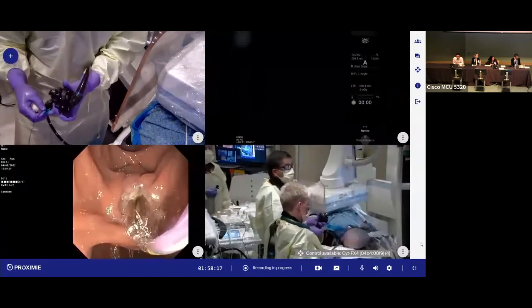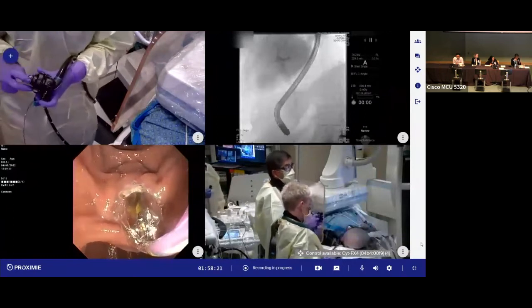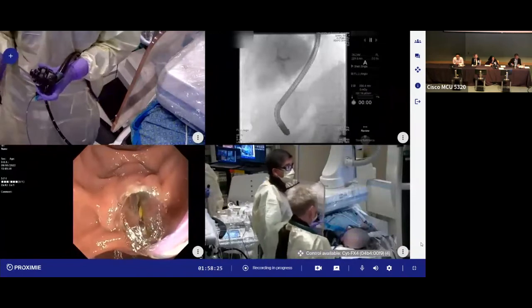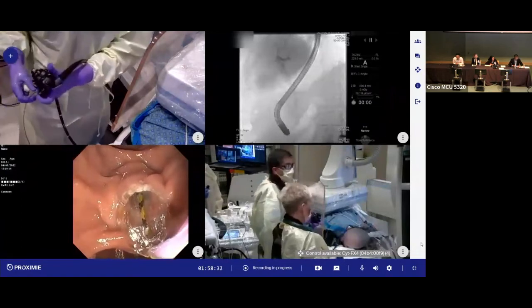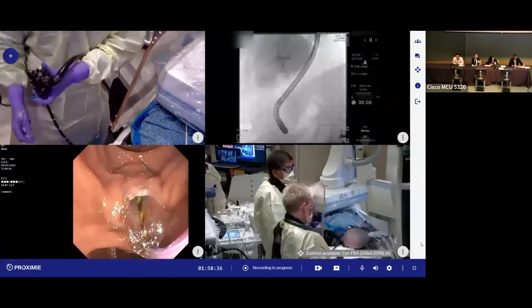I did want to make a comment that what I'm trying to do with this balloon, this is a short CRE, so it's a 3 centimeter balloon. We say it's short because it's over a short wire. The traditional CRE is 5.5 centimeters, and there's a little bit of contrast in here. Go ahead and go to 10, and we're going to take this up to 10.